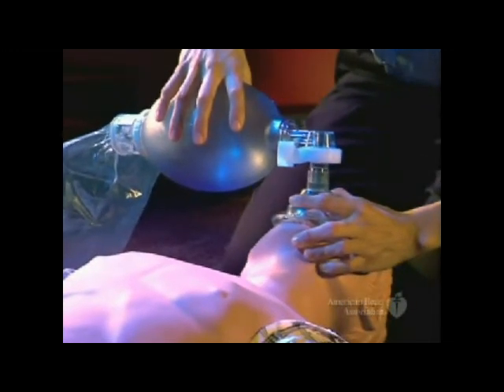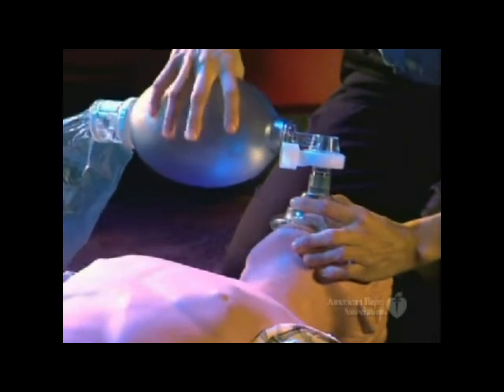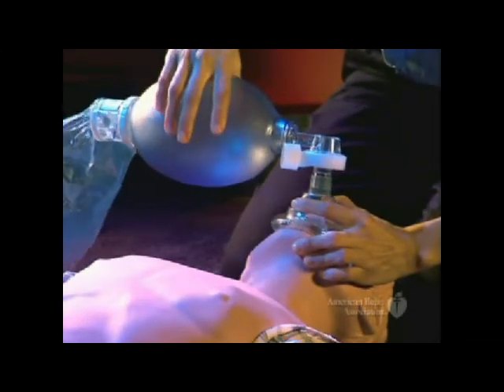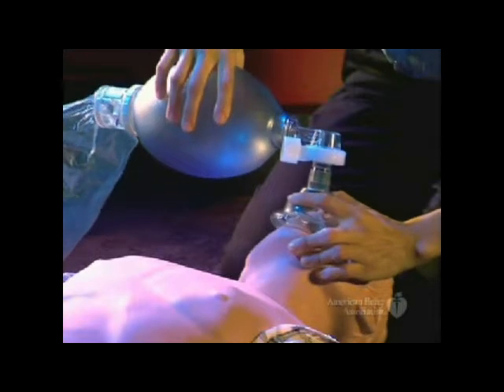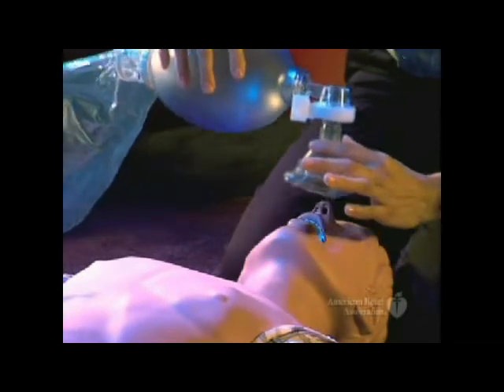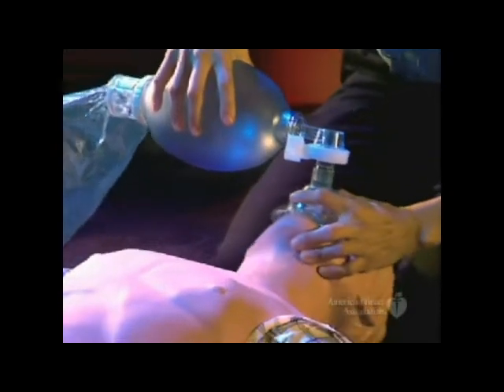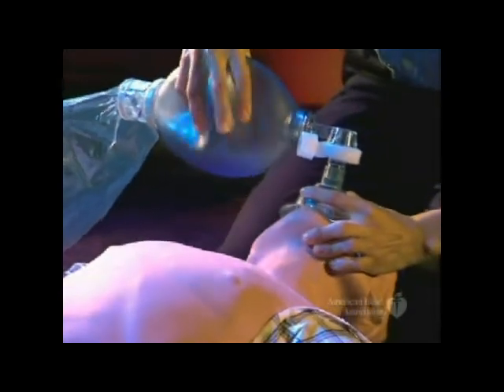Squeeze the bag with your other hand or push it against your leg or body. If the chest doesn't rise, then you are not providing adequate breaths. Adjust the mask, reposition the head and neck, or administer a larger amount of air. With or without supplementary oxygen, give one breath every 5 to 6 seconds. Practice this now for 1 minute.